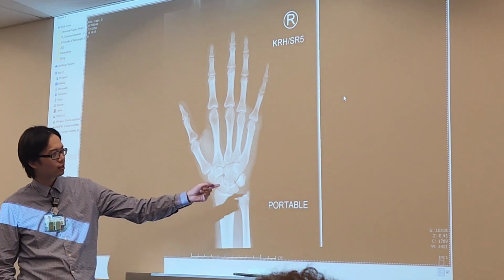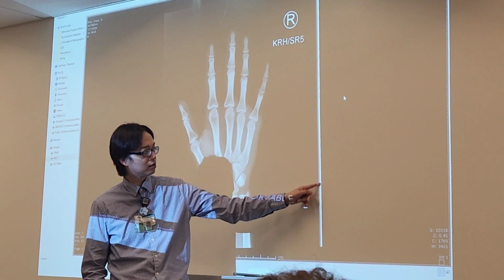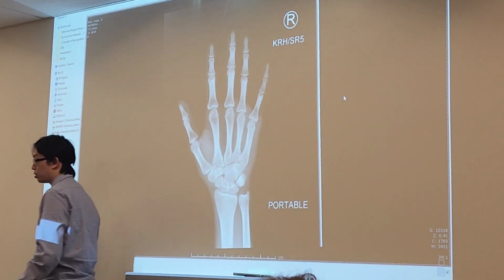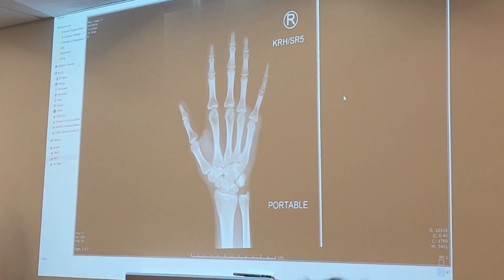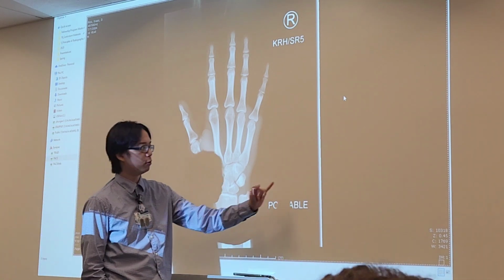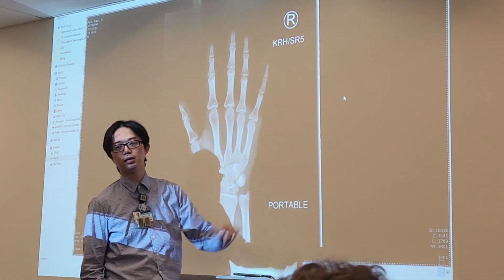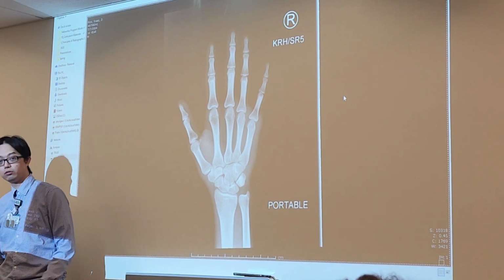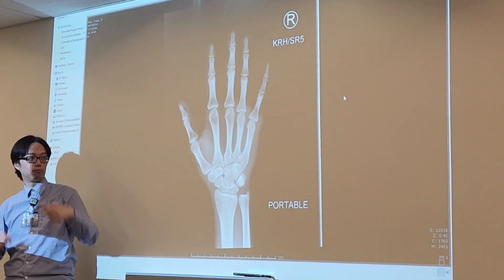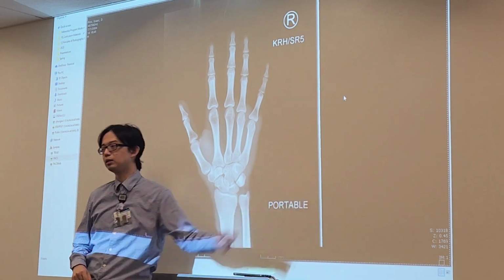Alright, so over here, right? You see this area of white fuzz? That's what I expect to see on a properly collimated image. If it's post collimation, then most likely I will not see any fuzz at all. Because normally when people collimate in post, they collimate smaller, which means that you will not see this fuzz.